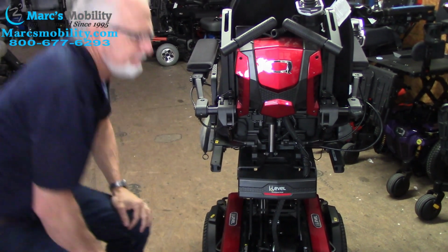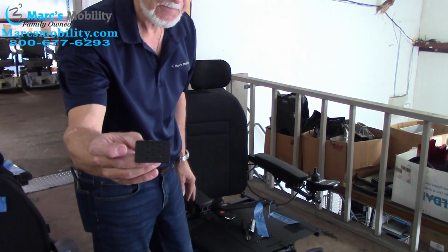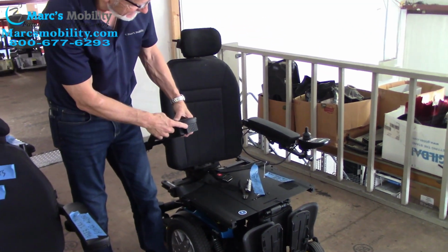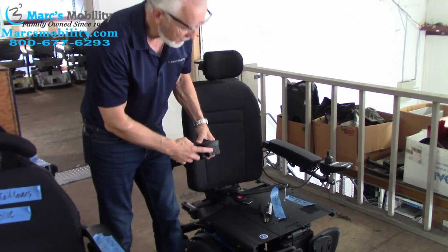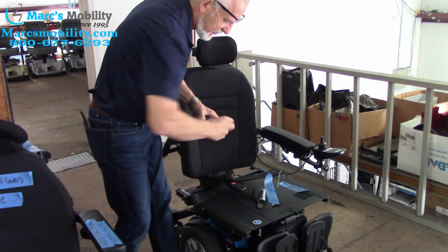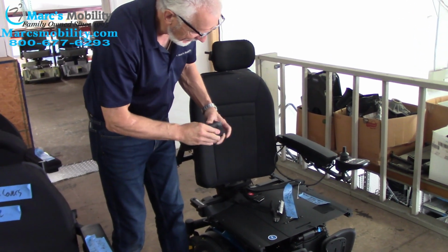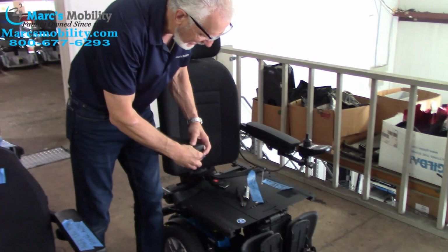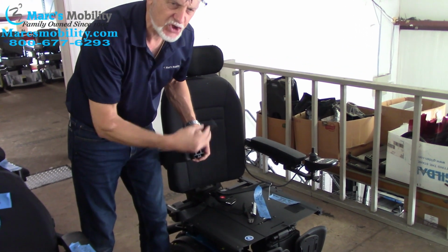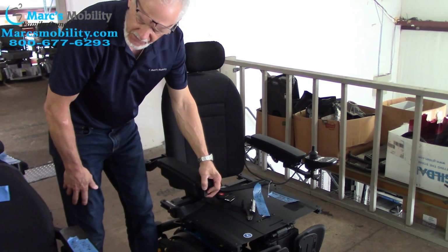Okay? So at the end of these arms right here, there's little cosmetic pads. You can see them right there. These little cosmetic pads, they just push into here. So, okay, see how it's there now? So you probably have those on your chair. You can pull them out with a screwdriver, or if you have real strong fingers, they just sit there to cover the end of the bar. So you'll have these two little tabs at the end of your arms. As a matter of fact, I'll have them on these arms. I'm going to send you these arms right here to you, so you'll have them.